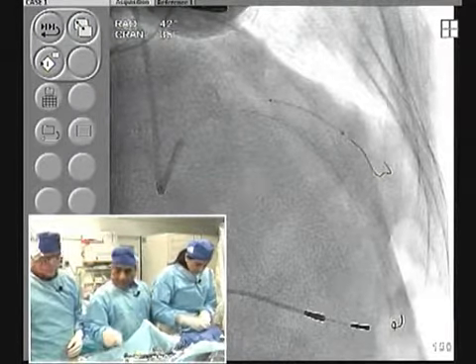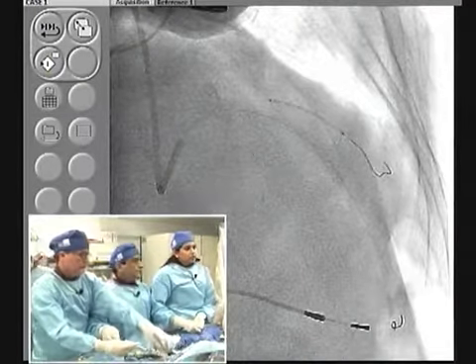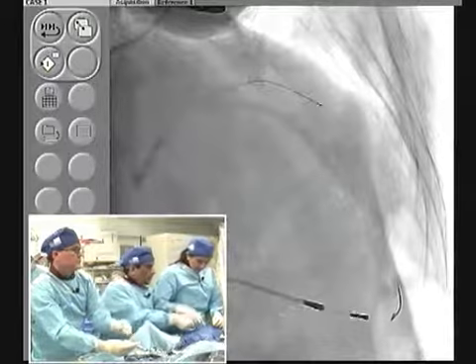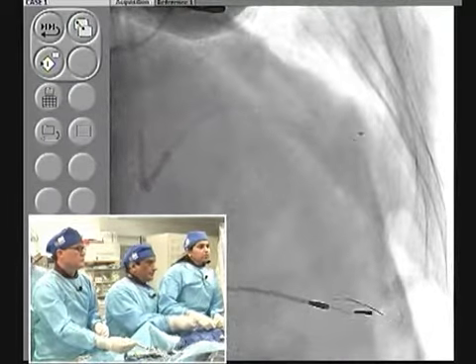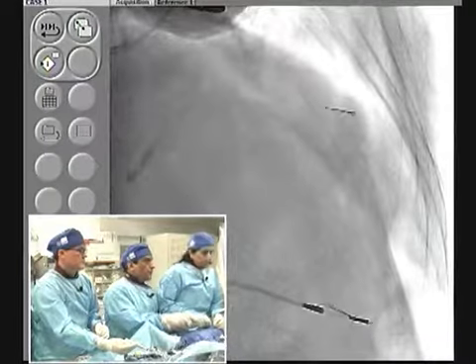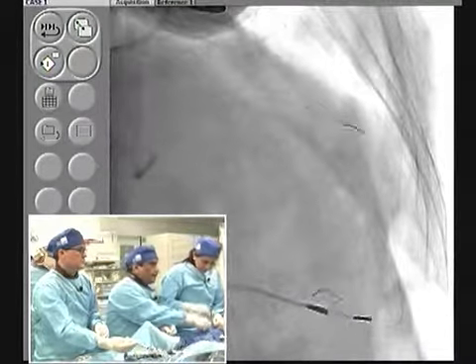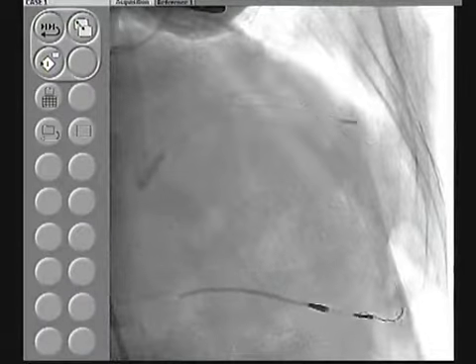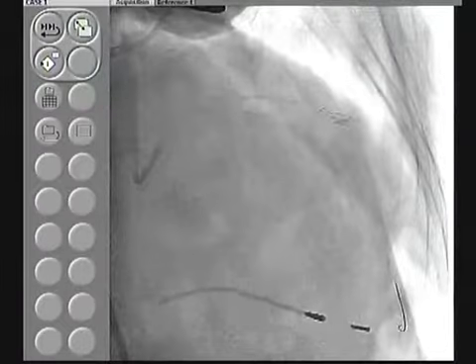So now we have done this. Show me, Laura. One second. You hold the stent and wire. So clearly you have to see. I'm pulling this out because it's not uncommon that they will crisscross. Pull this wire a little bit. Good. We have another 3-0, 23.